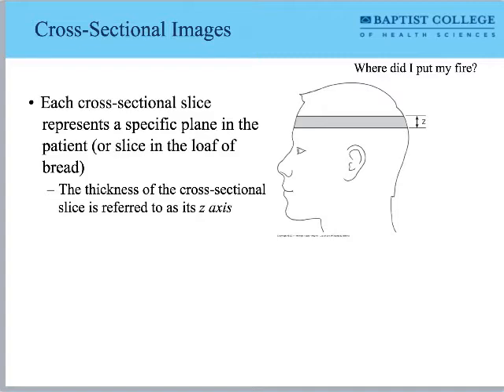More than that even, be able to take the patient's body apart and put it back together in different slice directions. Because really what we're interested in is not just the slice pictures, we're interested in how those pictures tell a story. They tell a story about a three-dimensional volume in space, the patient's body.